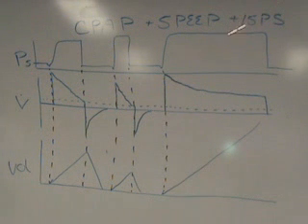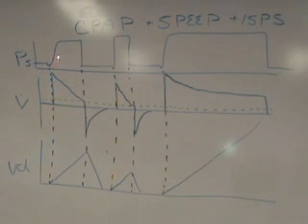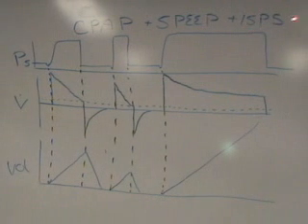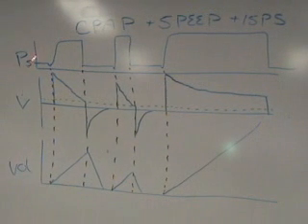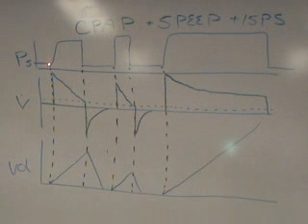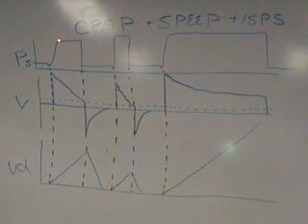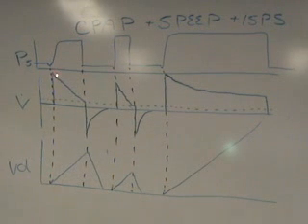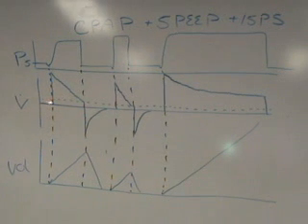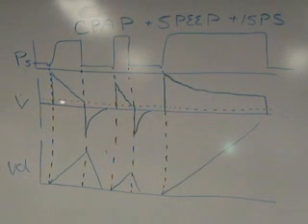So a pressure supported breath is only patient triggered. When the patient triggered the breath, the pressure went to a certain pressure level, in my case 15 centimeters of pressure support, above the baseline pressure. So this pressure is actually at 20, okay, because that would give me 15 centimeters of pressure. After the patient triggered it, the pressure went to that pressure support level, stayed at that pressure support level, until the flow rate decelerated to a predetermined point, usually called your terminal flow rate or your terminal sensitivity.